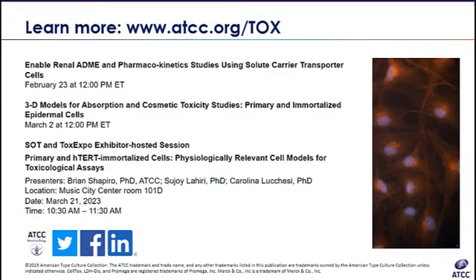All right. Now I think that this question was answered in the presentation, but Kevin, do hTERT dermal melanocytes lose melanin expression? No. The actual melanin expression can be observed and quantified during the subculturing, when we pellet cells in their suspension.